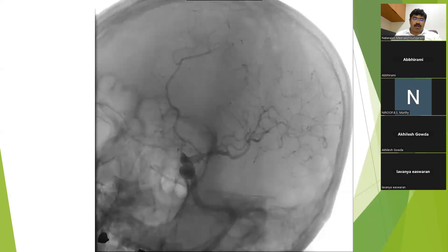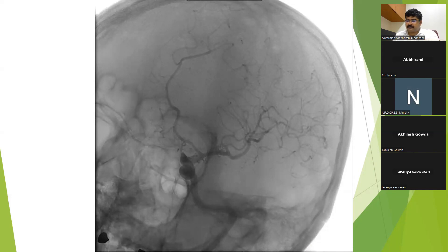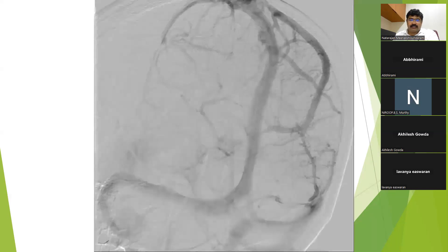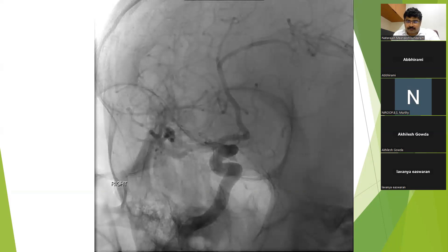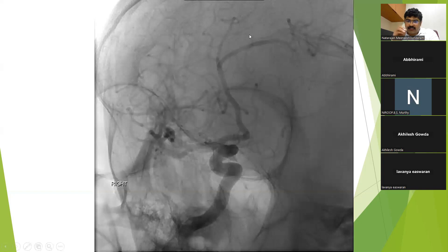This is the transorbital oblique view, which gives a 3D orientation to the arterial vasculature, showing the arterial phase and the venous phase. This is the reverse transorbital oblique view. A detailed description of each vessel based on these various views will again be discussed in the corresponding webinars.